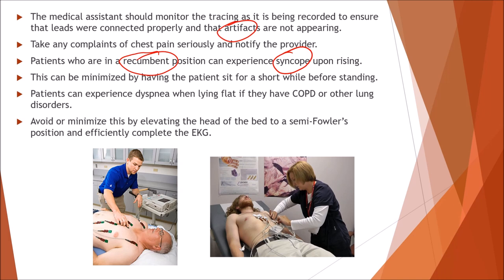Fainting. Now, some patients might have dyspnea and might not be able to lay flat. Dyspnea means trouble breathing. So you might want to place them in a semi-Fowler's or maybe even a Fowler's to be able to do that EKG. Semi-Fowler's might be one of your best bets.